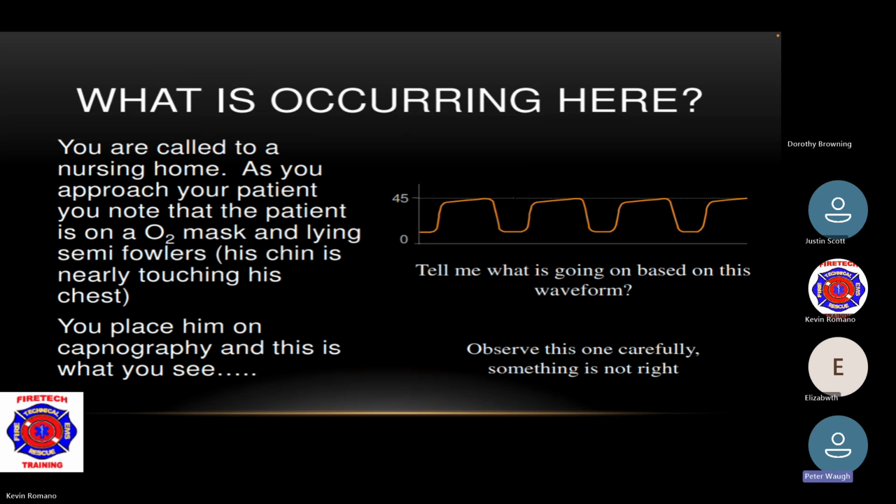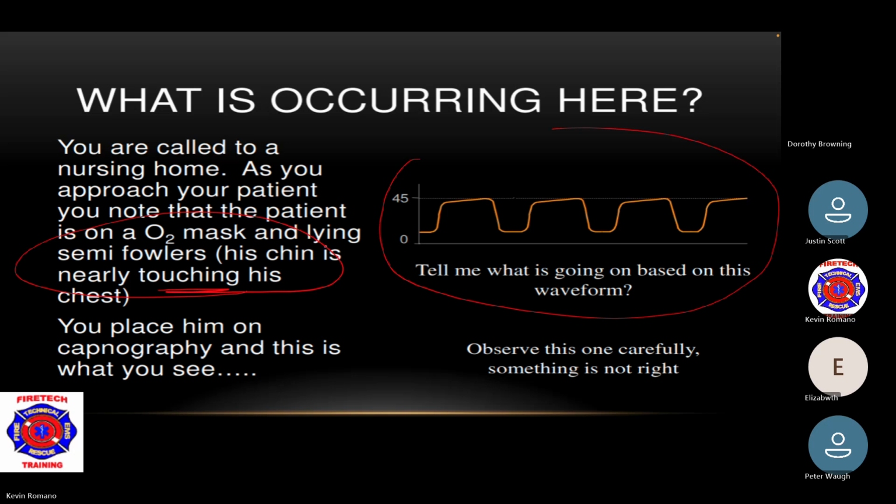His chin is down, so he's cutting off some of his airway. He should be sitting up higher, a little straighter. Okay. So you caught that part there, nearly touching his chest right here. What do you see wrong with this picture though?